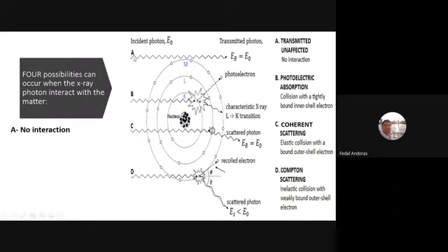No interaction, just going beside the atom without hitting the nucleus, hitting an electron, doing anything. Just going out. Okay? And again, this X-ray is not absorbed, not scattered. If anyone is standing in front of the X-ray beam, this one will absorb the X-ray. So it's too hard. We will talk about this later. So first of all, it's no interaction.